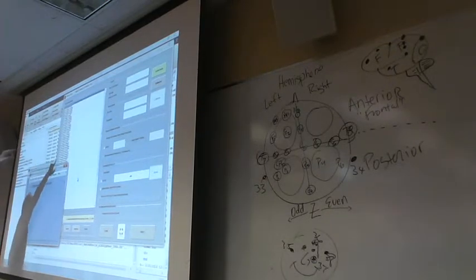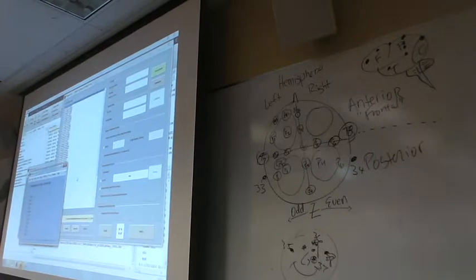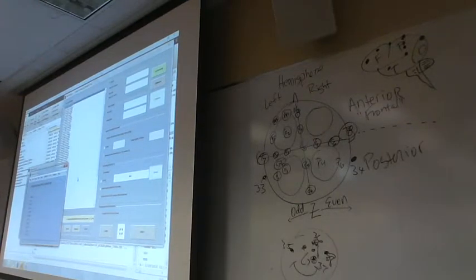So we're going to type SC for source correct, and put an H there for high confidence. So this is like writing a code for a puzzle. Now we have a label that goes with this code. Because you don't want to have to memorize what each of these 4-digit wacky numbers are. That would suck, spending the semester going home and trying to memorize these things.